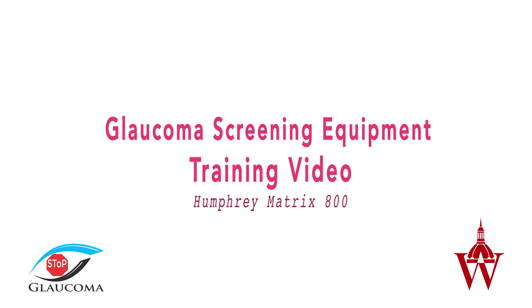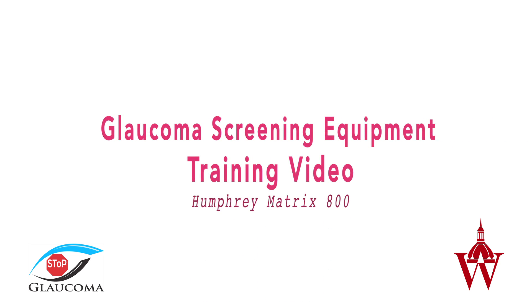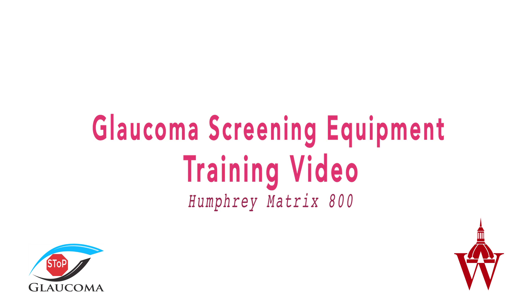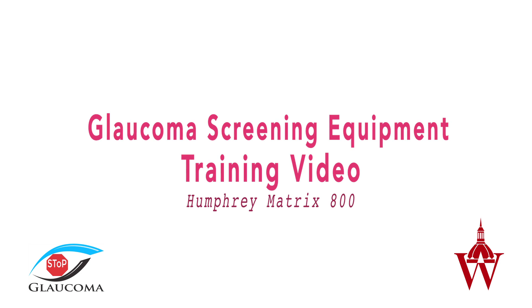This is the training video for the Humphrey Matrix 800 for visual field testing of the Baltimore City Glaucoma Screening Program, organized by the Wilmer Eye Institute of Johns Hopkins University.